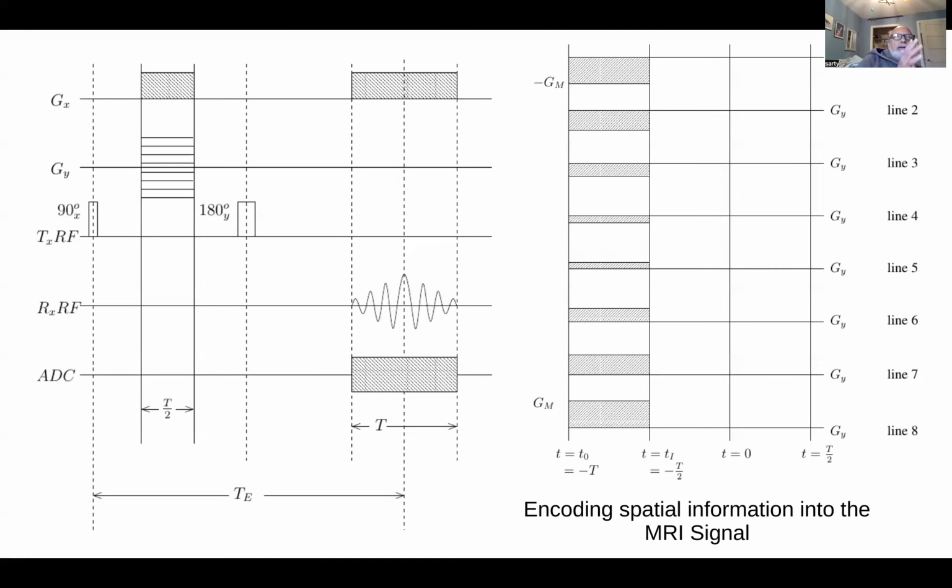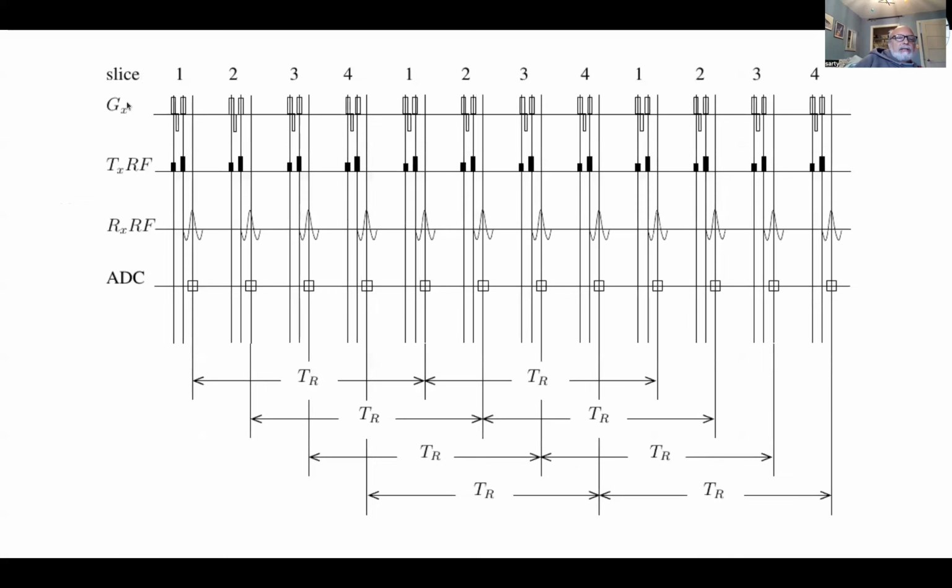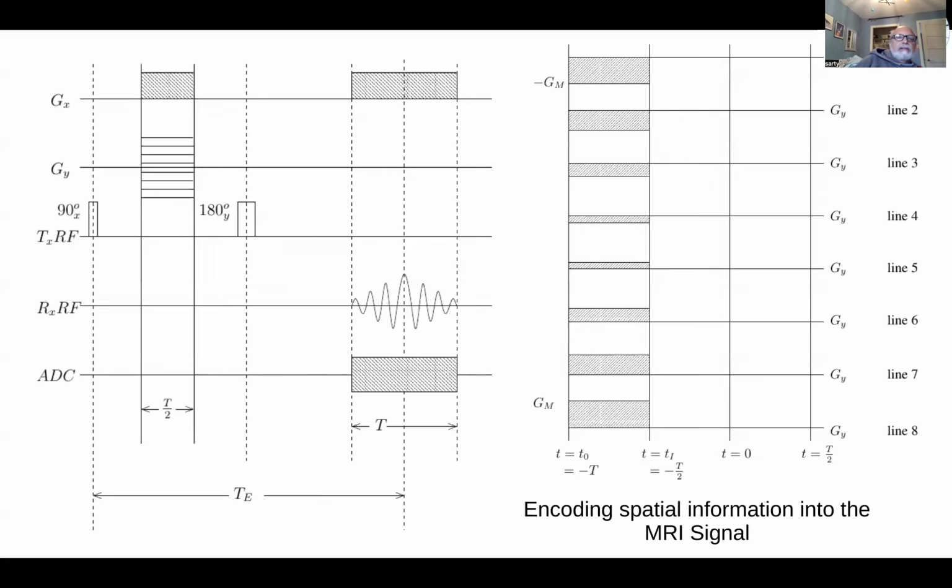So this is a practical thing that you'll need to sort out in your mind and sort out in your pulse sequence programming in order to get images on the excited slice. So to keep things simple though, let's imagine this is in the Z direction, and then the X and Y direction is what you need to worry about to form an image in the XY plane that coincidentally in this case will correspond to the transverse plane.